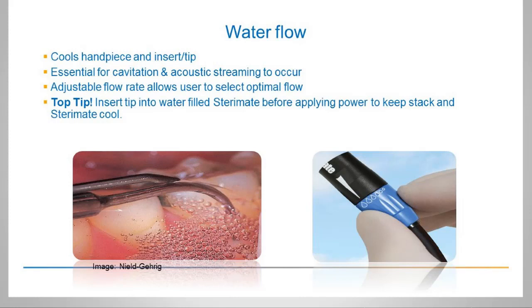And my top tip here is to insert the tip into a water-filled Sterimate before applying the power. This keeps the stack of your insert cool, so it creates longevity.